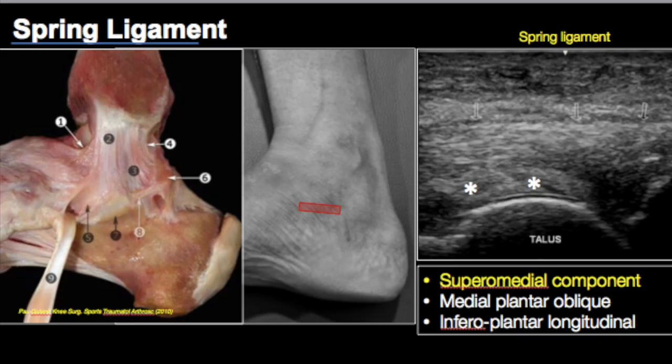The spring ligament proper is seen as a broad echogenic structure, and the tibialis posterior tendon lies just over it. The position of the probe is almost parallel to the sole of the foot. When evaluating tibialis posterior dysfunction, after assessing the tibialis posterior tendon it's a good idea to look for spring ligament tears as well. On MRI we can see all components of the spring ligament; however on ultrasound, all we can see is the superior medial component, which is the most important one.